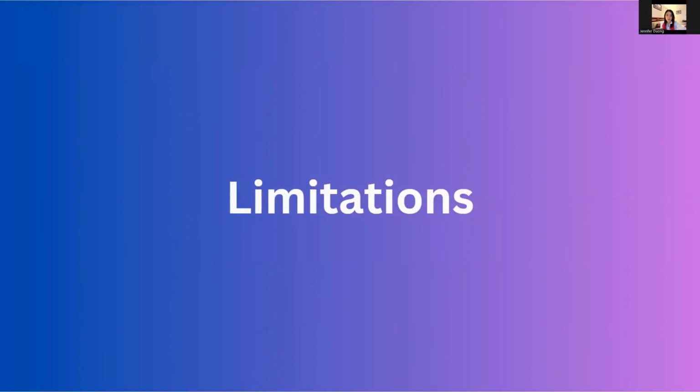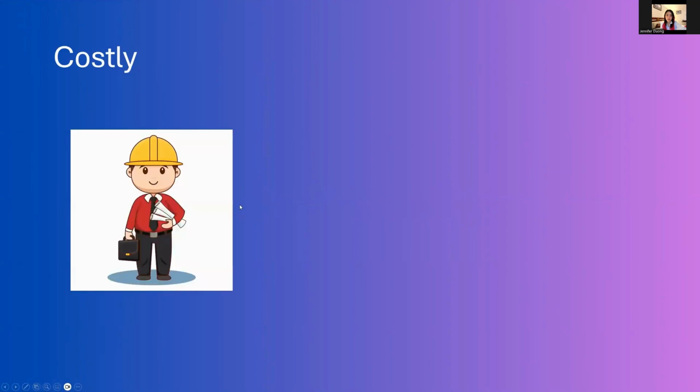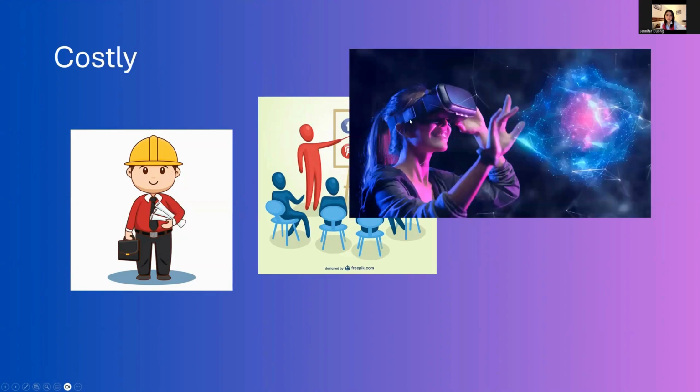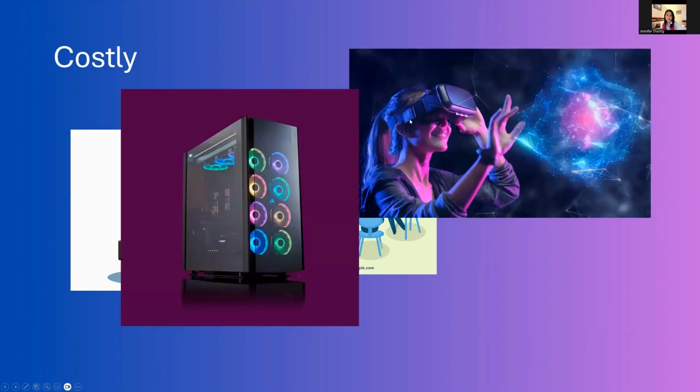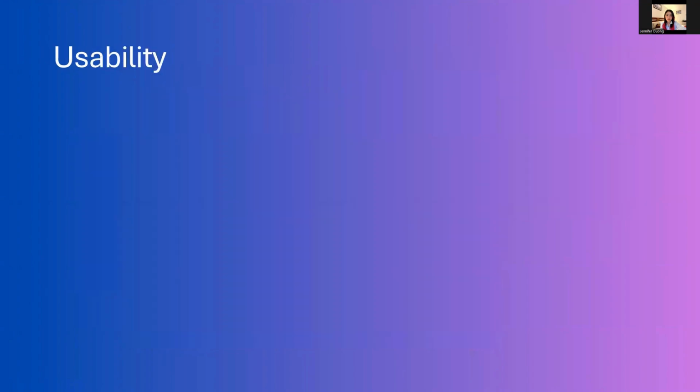Whilst we do see how much support VR provides in orthopedic surgery, there are still a lot of limitations that we should address. The first one is that it is quite costly. We need to pay the engineers to set up and teach us the system, pay and train the surgeons on how to use the system, pay for the VR headsets, pay for the PC that the simulation runs on, as well as pay for all the scans we might take. Overall, it is very costly and may be out of budget for smaller hospitals.